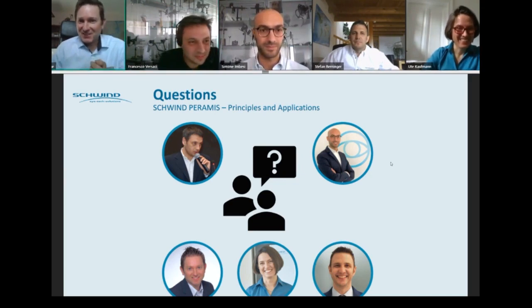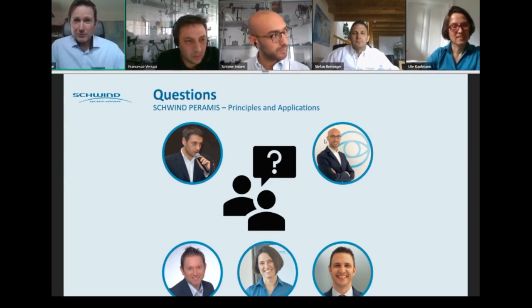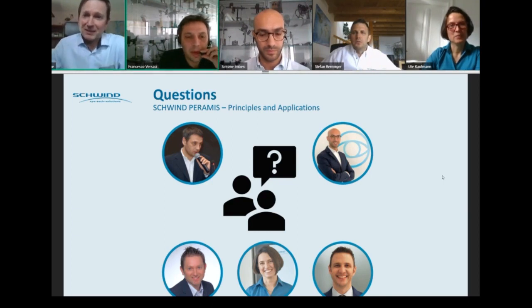Yeah, basically, of course, there's a way to select aberrations, but not inside the Peramis. You can play around there, but if you really want to treat selective aberration, you would do that inside the SCHWIND CAM software. And maybe I can already announce that we are currently planning another webinar, which actually has the topic of customized treatments. So this might then follow up on this question you were having.